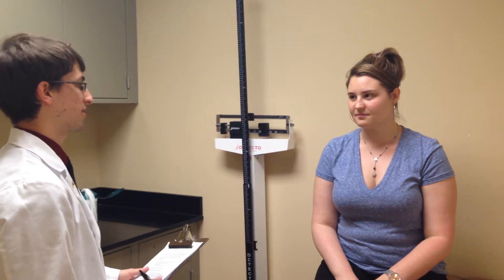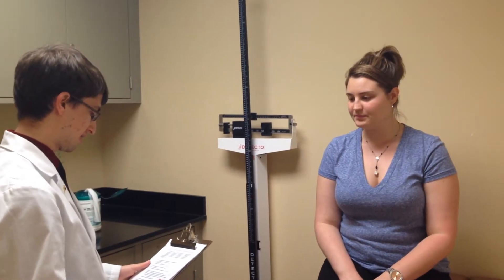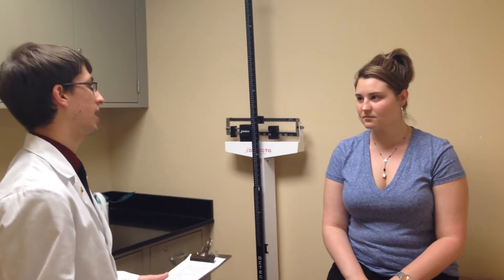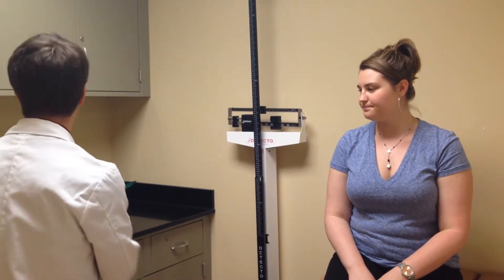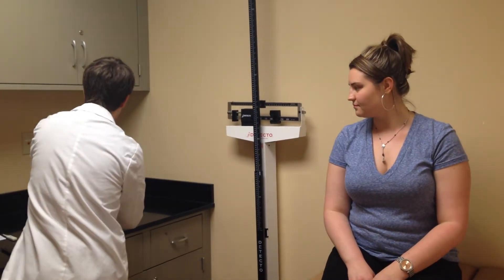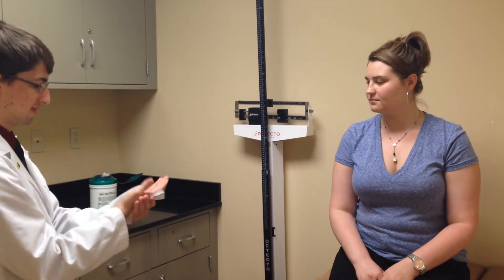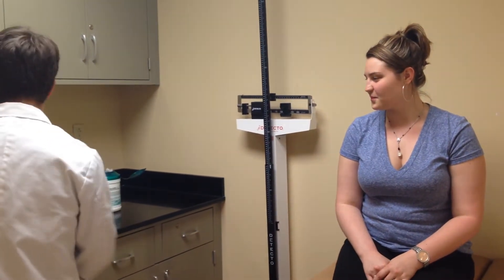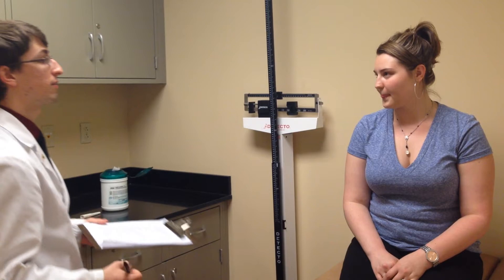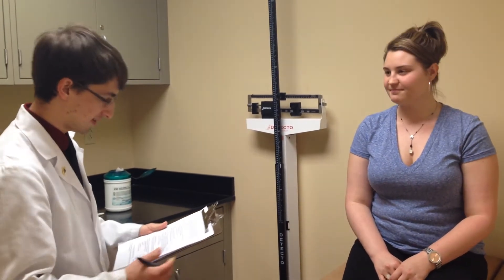Hi, my name is Michael O'Quinn. I'm a pharmacy student. I'm going to be doing a physical assessment for you today. I'm just going to be taking things such as temperature, pulse, height, and weight, and basically calculating BMI, just to see if you're okay. So I'm just going to wash my hands first, because it's sanitary. Are you ready for a physical examination? Okay, cool.